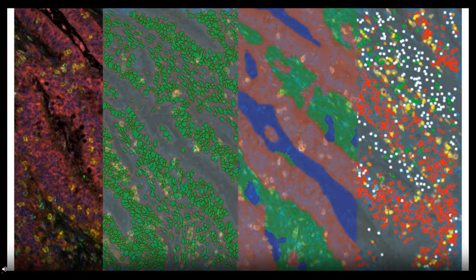The next image along is a tissue segmentation image, which has separated the image into different tissue compartments. And then the final image on the right is cell phenotyping, where each of the objects from the second image, each of the cells, have been assigned a phenotype represented by different colours there.